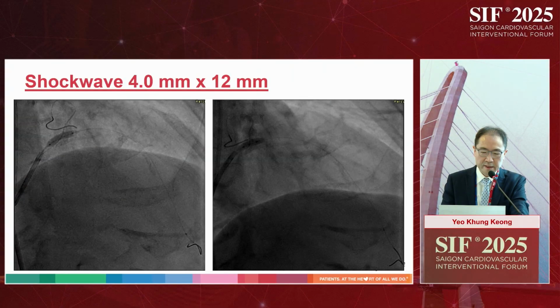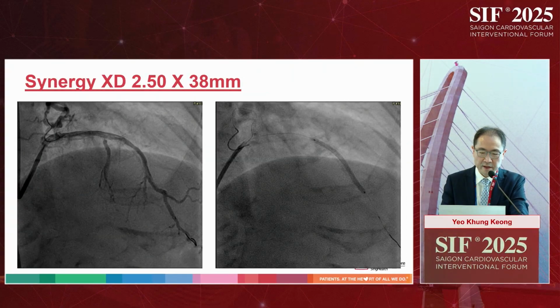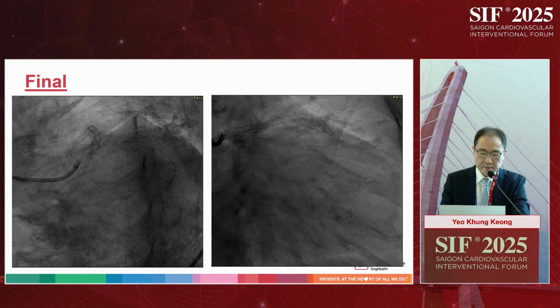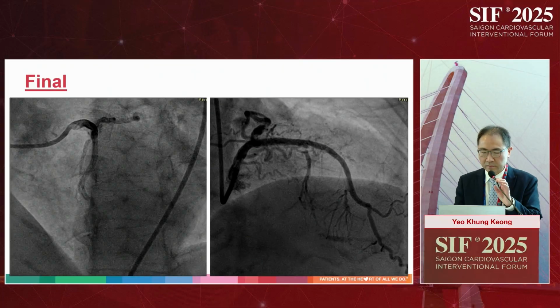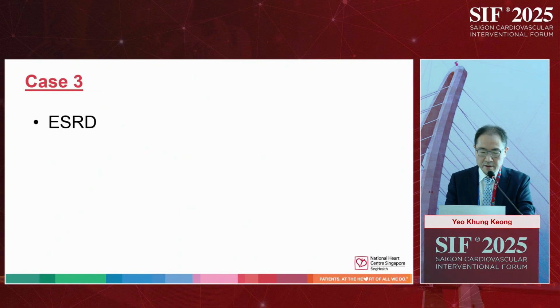And you can see that the left main into LAD continue to have calcium, and we had used Shockwave and all sorts of other technologies to manage that. Now, given the time considerations, I will only have time for one more case to illustrate some of the discussion.